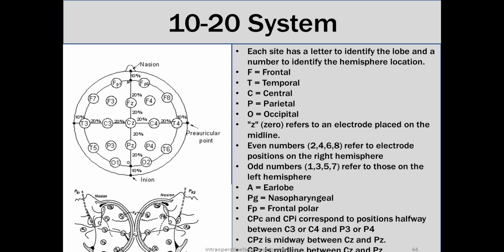From there, all you have to do is memorize the locations, which you should be somewhat familiar with from actually doing SSEPs and EEGs, so that you can quickly add that up. So they might give you a head circumference and ask what is the distance between CPZ and CP4, and you would just have to know that it's 20% of that number that they gave you.